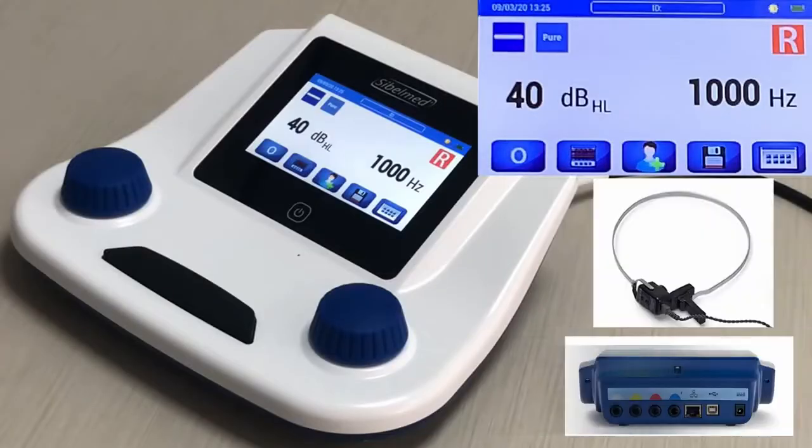To make a test with the bone conduction, we will connect the B71 vibrator and select the test by pressing on the first icon. We would perform the same procedure we did using the air conduction.